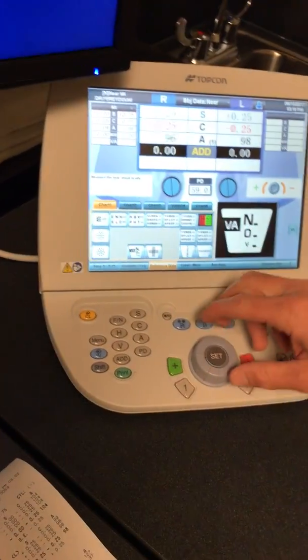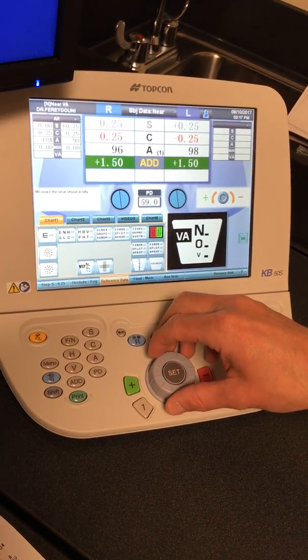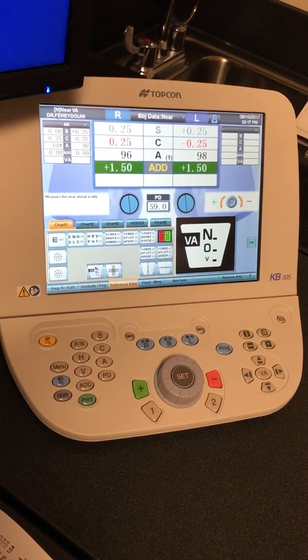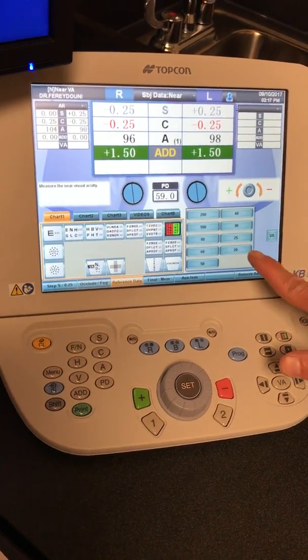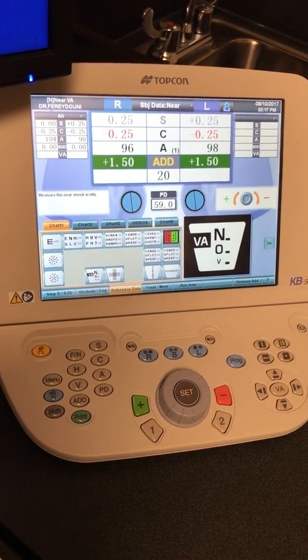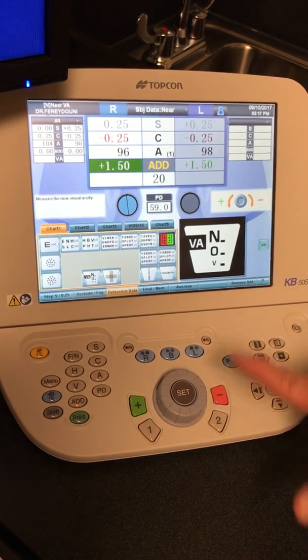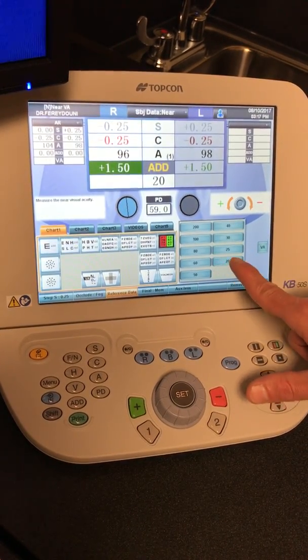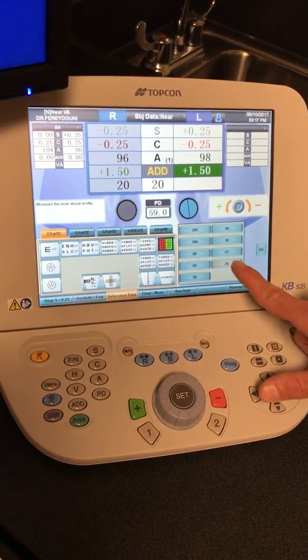It has the add right here, so you can dial in the add. Give them +1.50 and ask them to read the letters. Once we have that set, you would hit the VA over here and give them their VA for their near test — and they were 20/20 — and it'll put that in binocular. If you want to do the binocular version of that, we could do the VAs 20/20, and on the left side, the same thing.